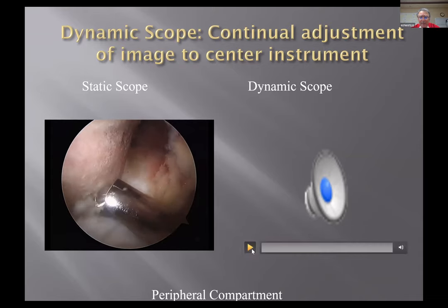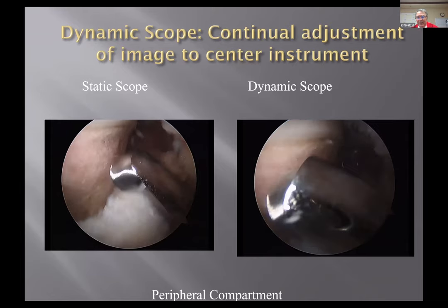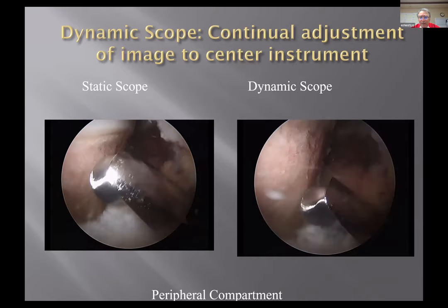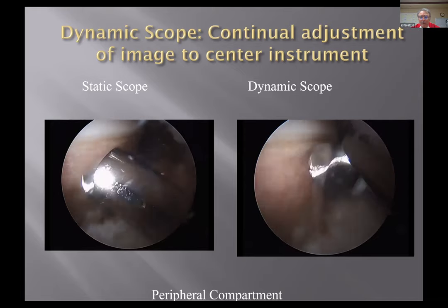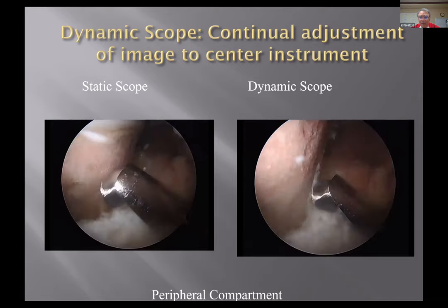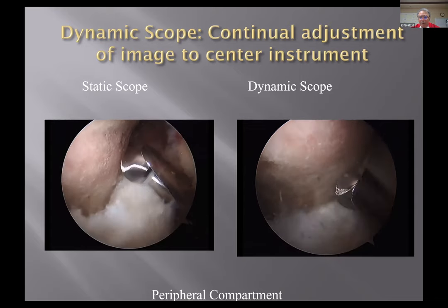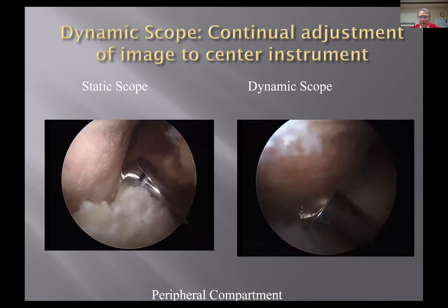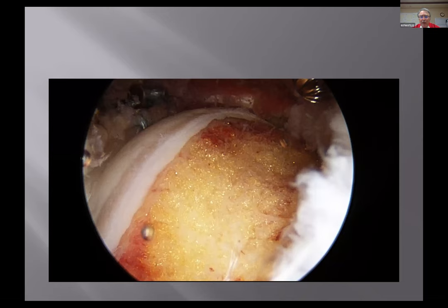And on the right, this is where the scope is moving as the burr is moving. And it's more of a dynamic arthroscopy to reshape that femoral head, and you have to get way down. That's why we have to open the capsule on some of these people, and you're just gently making that a bunny slope. So when you're done, that labrum's repaired, the CAM lesion's gone.